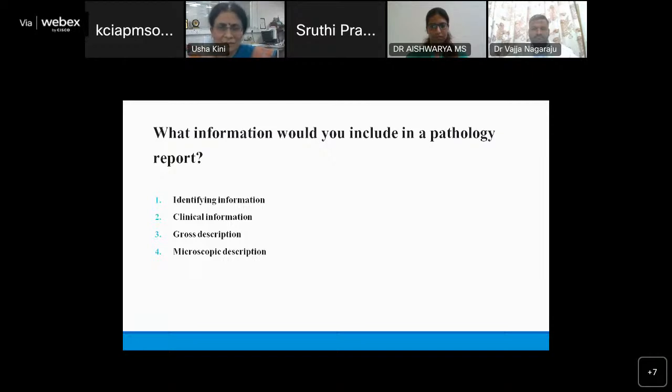So in other words, the report that you give is something that has happened in your lab from the moment the sample has reached, and from the moment you diagnosed and you approved and released the report. And the most important, after the microscopy, is of course the impression. Impression comes with a comment. Impression is where you summarize the morphology to a one-liner saying this is what it is. And the comment is based on that, what you want to tell the clinician.